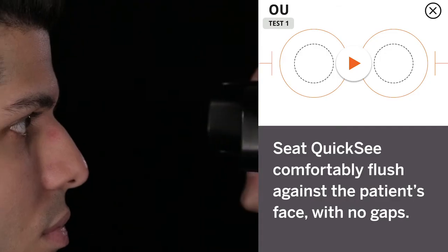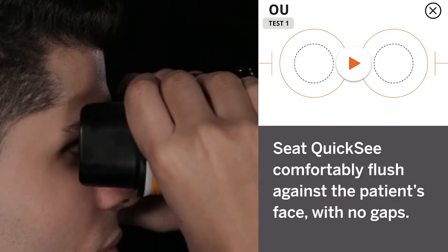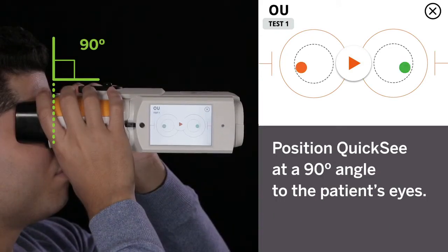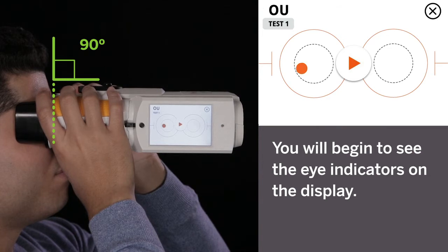Second, seating. Seat QuickSee comfortably flush against the patient's face with no gaps. Position QuickSee at a 90-degree angle to the patient's eyes. You will begin to see the eye indicators on the display.